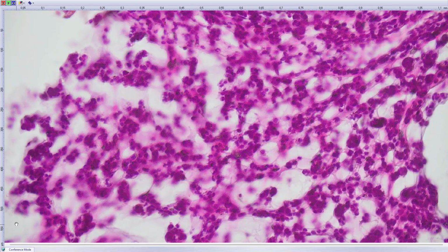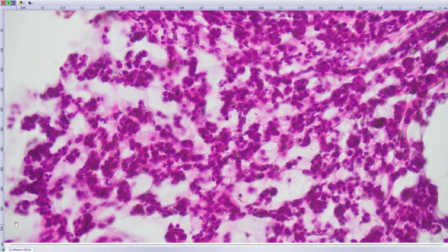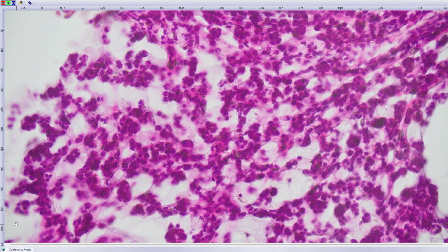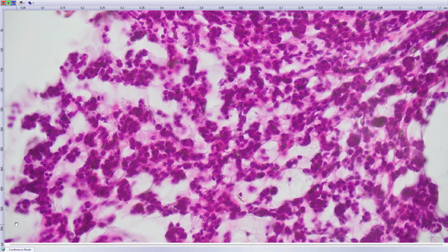Okay, so we have spoken about so-called myoepitheliomas of soft tissue here several times, and it's probably a very heterogeneous category of tumors, and I believe that some of these tumors previously classified as myoepithelial tumors, myoepitheliomas or myoepithelial sarcomas of soft tissue, probably will go into the category of extraskeletal myxoid chondrosarcoma, because you cannot distinguish between them by immunohistochemistry.